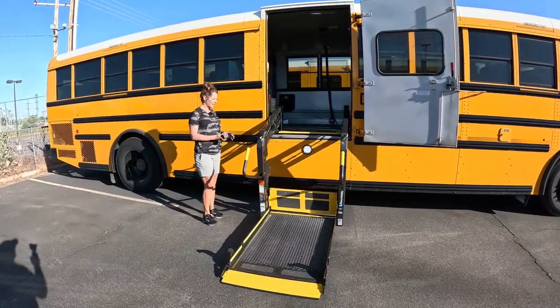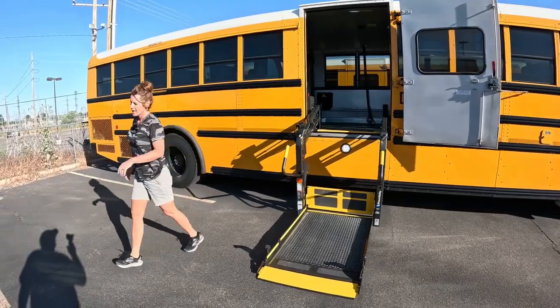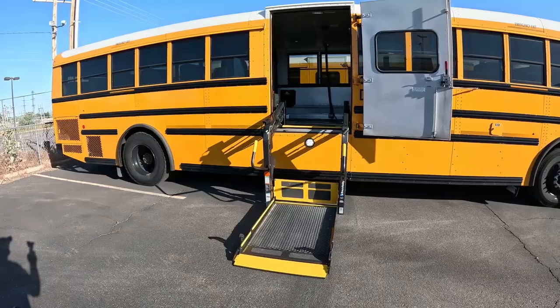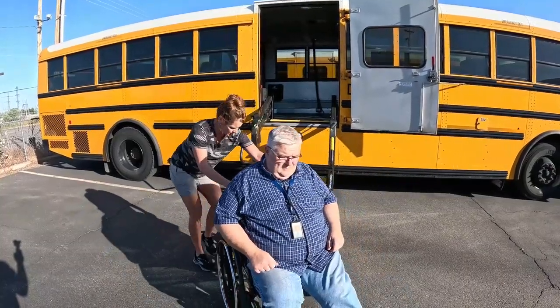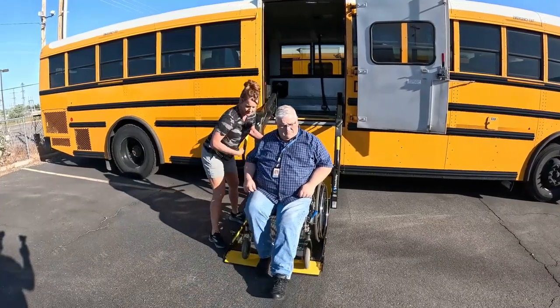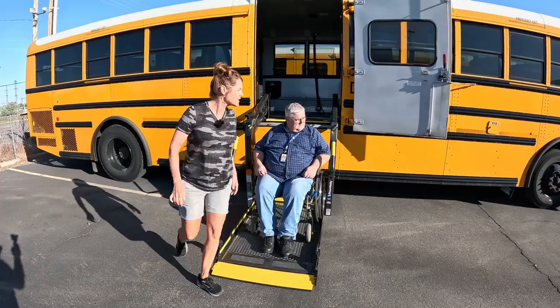Most of these are magnetic, or they have a little hook. You can just hook it on here while you're loading the wheelchair. The wheelchair goes in backwards. Usually the student will help you or a parent will help you, but you want to make sure you put the wheelchair on backwards. Once the wheelchair's on the lift, you want to make sure it's locked, both sides.